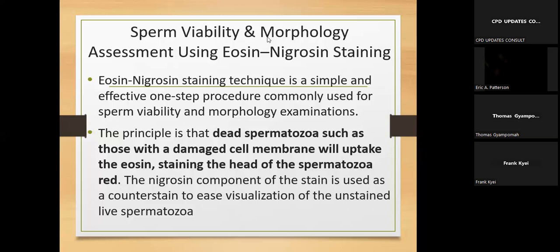Negative stain stains the background, but not the cells itself. What is negative staining? Yes, answer coming. Very good. Felix, great. You made it.